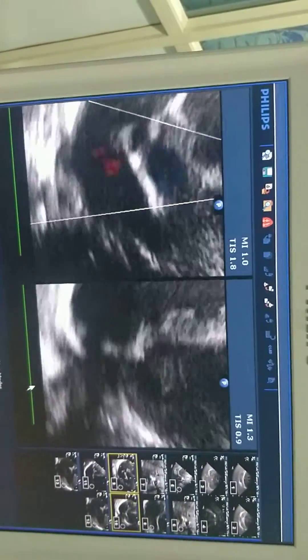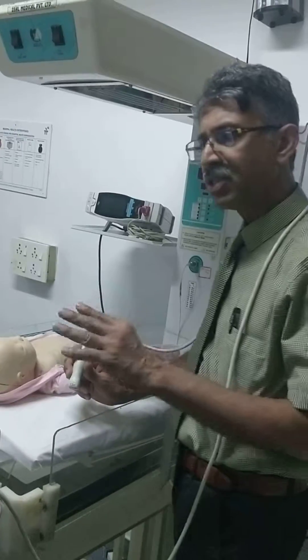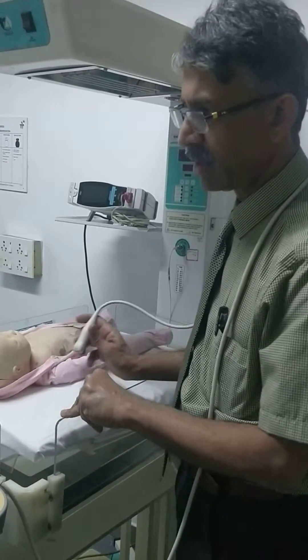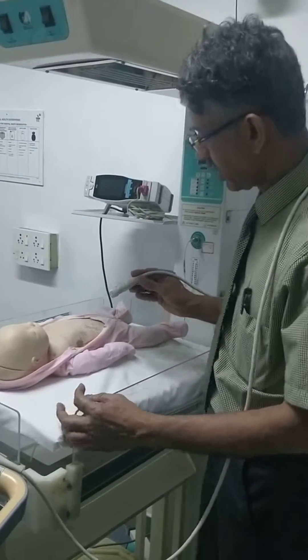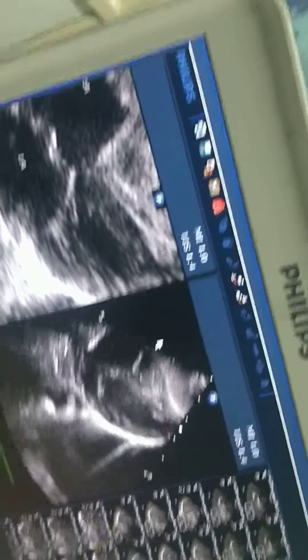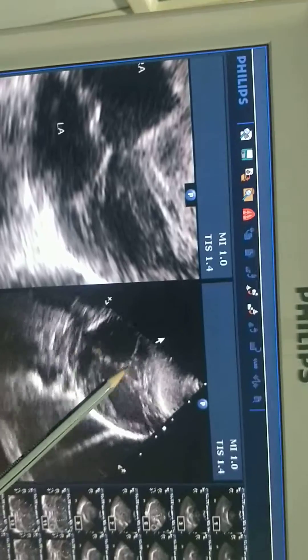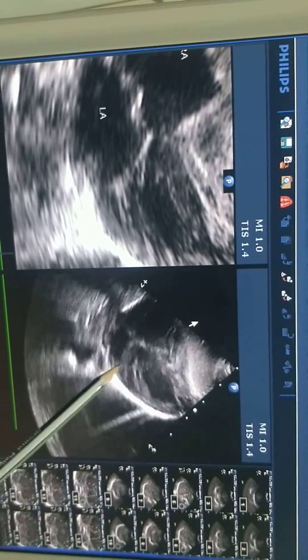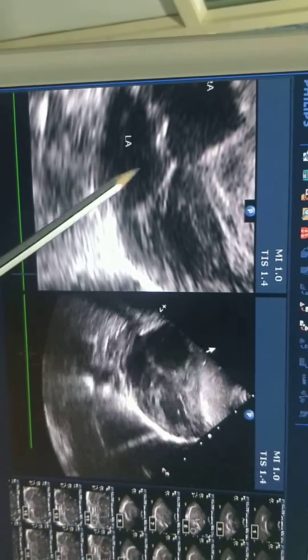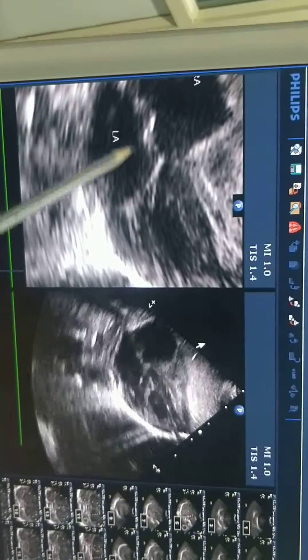After knowing the venous connection to the atrium, you have to demonstrate the morphological differences between the right atrium and the left atrium. To define the morphological structures, the probe is kept in the subcostal area. Just tilt up to view the right atrium. You can see the right atrium — it is broader, blunt, and trapezoidal in nature. The left atrium is narrow with a finger-like appendage. In the still image also, the right atrium is trapezoidal, also described as triangular, and the left atrium is narrow with a finger-like appendage.